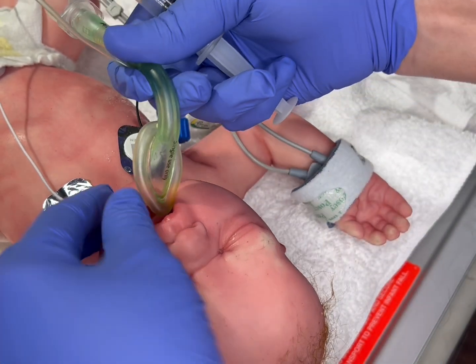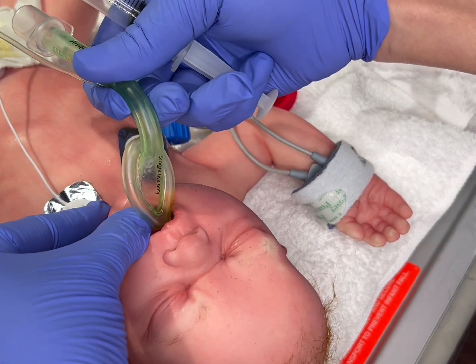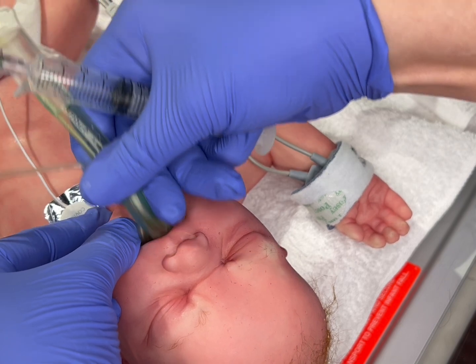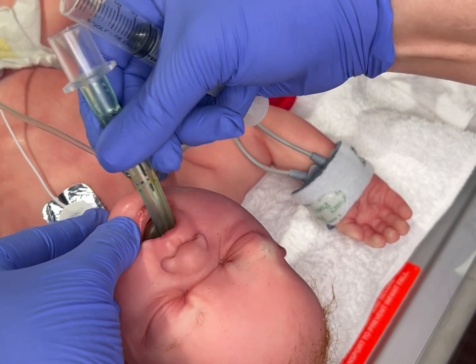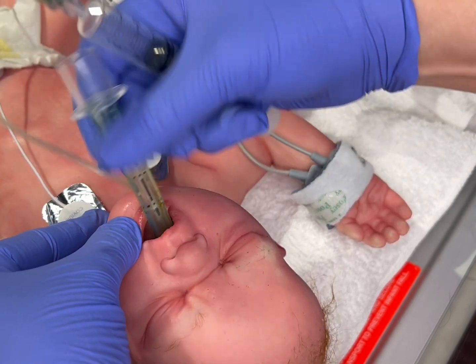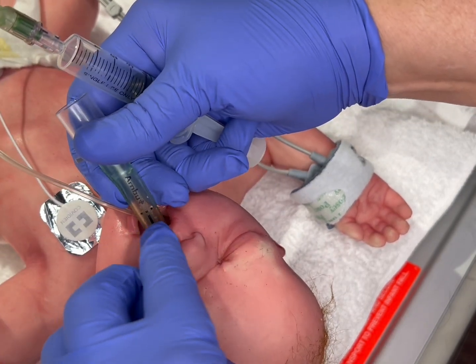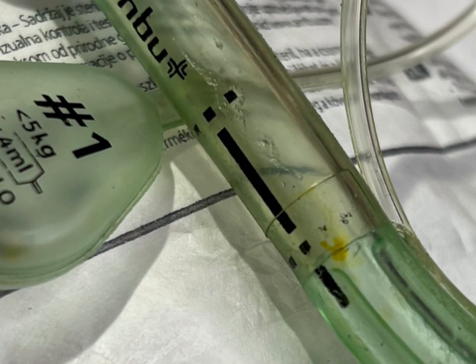Now the operator will stand at the head of the bed. They will secure the patient's tongue. Then they will slowly advance the LMA with the cuff's opening pointed toward the patient's body, as seen here.